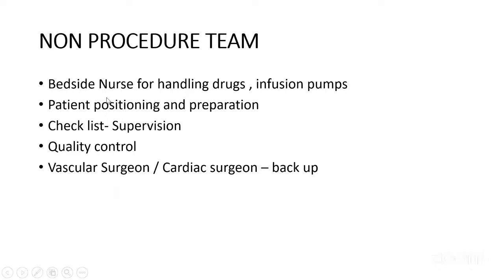So the non-procedural team consists of a bedside nurse for handling drugs and infusion pumps, because the patient is not yet on ECMO. He may be requiring high vasopressor support. There might be multiple medications, multiple infusions going for these patients. The patient positioning and preparation for the ECMO are all taken care of by the non-procedural team. Checklist needs to be seen and supervised by those people. I'll come to this checklist in detail, because for the preparation of the ECMO we need to have a good checklist which will decrease the risk of any mishaps during the procedure.